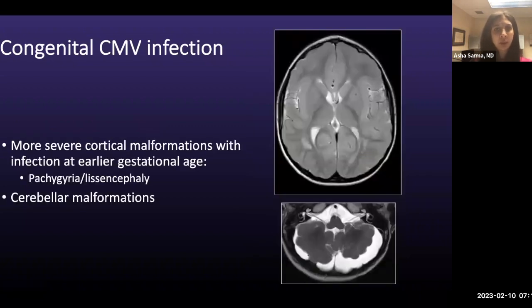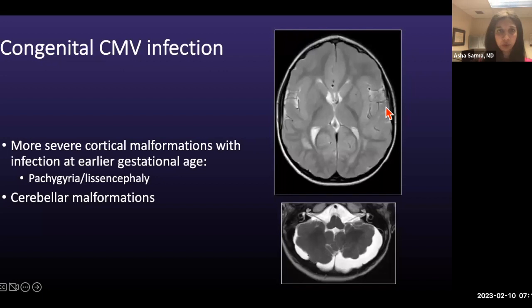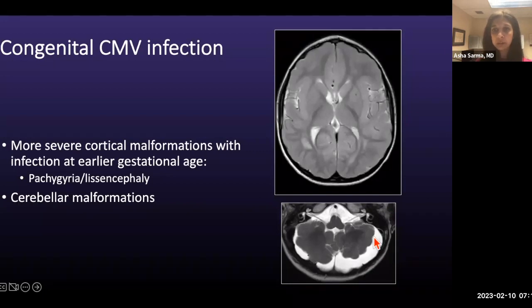If infection occurs earlier in the second trimester, the cortical malformation may be more severe, such as pachygyria or even lissencephaly. Here is an example of cerebellar malformations that might occur. Normally, the cerebellar folia should parallel the occipital bone, but in this case you can see a granulated appearance of the cerebellum with an abnormal foliar pattern.